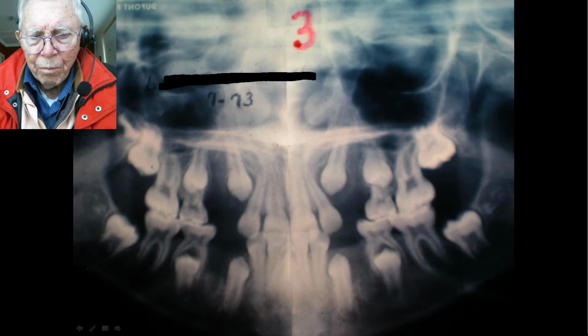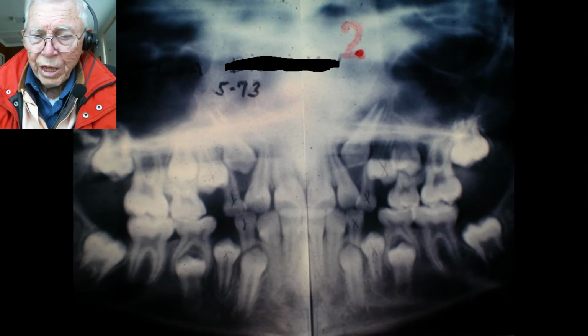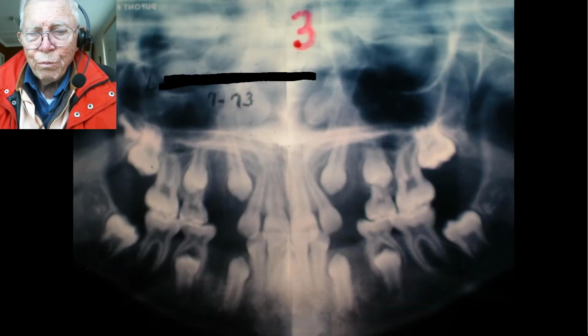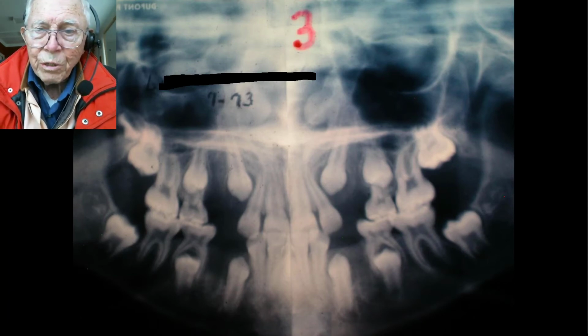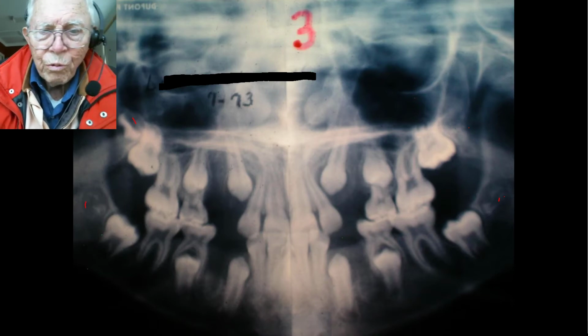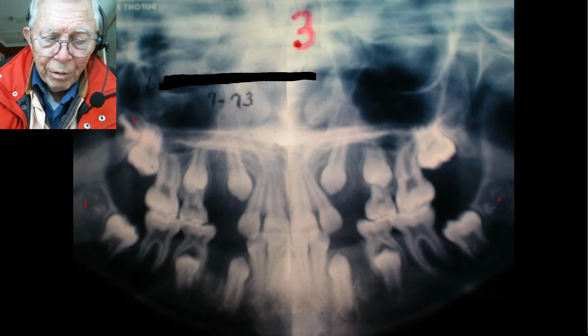I'm going to go back now. I just wanted to kind of remind you, see where those cuspids are. We took those teeth out, and then 2 months later, watch the follicle on each of these, and look how they move back away in just 2 months. I'm not putting anything in there except just guiding the direction of them. Now you can see the wisdom teeth developing back in here. And so we don't worry about not having teeth. We're going to have plenty of teeth to put in the mouth there.